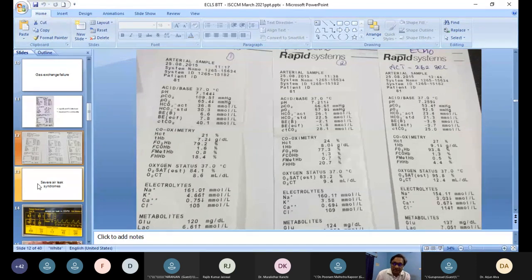But the great advantage in patients waiting for a transplant is the quality of life. Here you can see a very frail lady. So if she was on the conventional ECMO and you took her to a lung transplant, by the time she had critical illness, myopathy, and sepsis. But with this cannula, you can, in these patients, mobilize them, build their muscle mass. They can do physiotherapy. They can engage with their relatives and so on and so forth. The quality of life for these patients, while they're awaiting organ, is quite good.